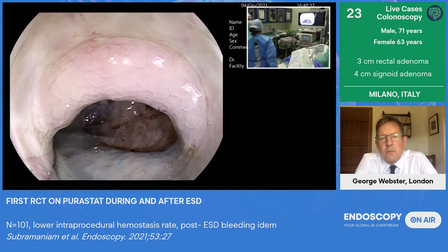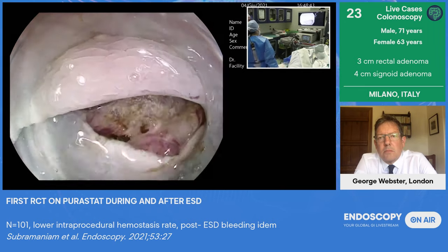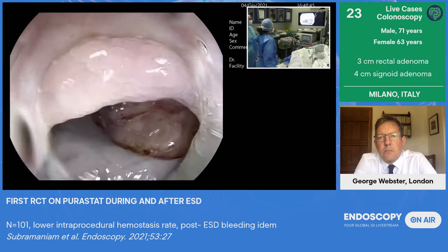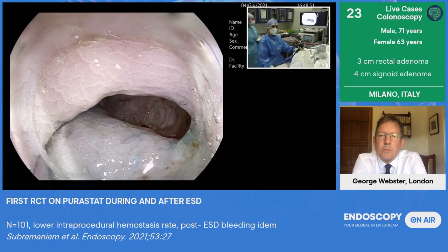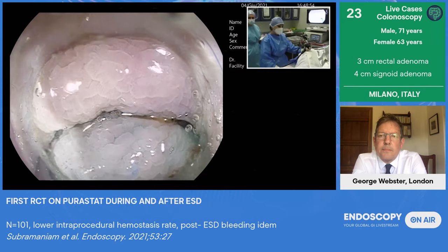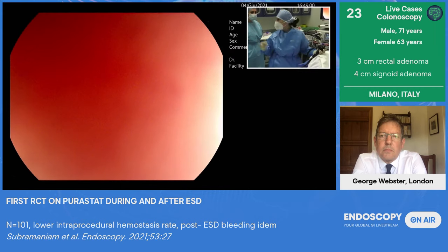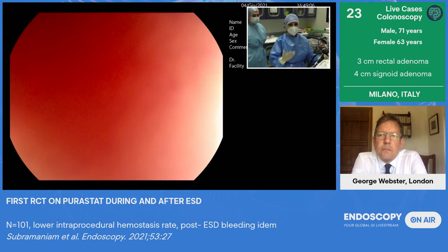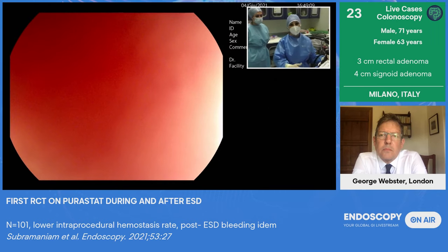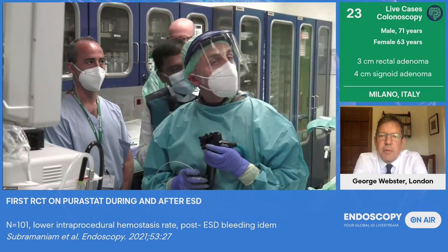Roberta, do you think we have to use it in IBD? Because even with other studies, it could enhance wound healing as well as prevent delayed bleeding. Yeah, Asma is completely right. You know that with Purastat, in one way we prevent the bleeding and we can achieve hemostasis of the bleeding point. But it also helps you have nice healing of the scars. Because in IBD we have this type of inflammation and then healing, and later on with the ESD, it's again a type of ulcer that we are provoking on the wall. So it helps you in the healing process. So it's very true. Fantastic demonstration. Maybe you have to really use the mic, Asma.